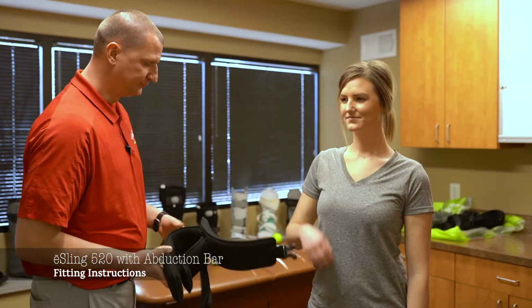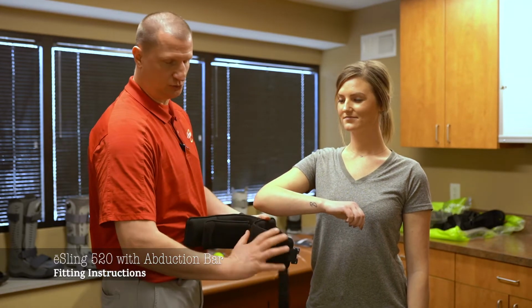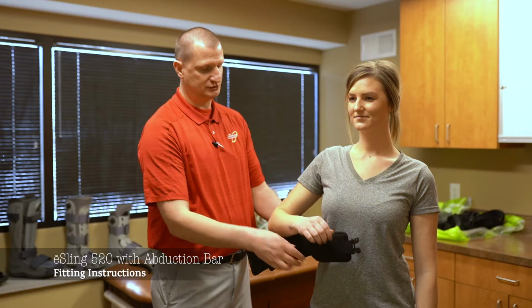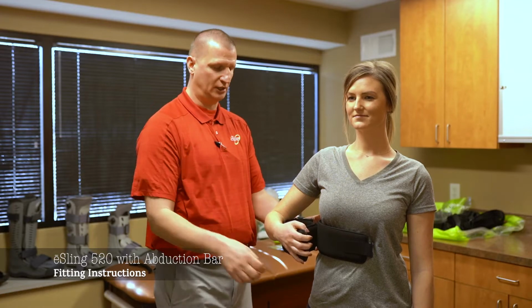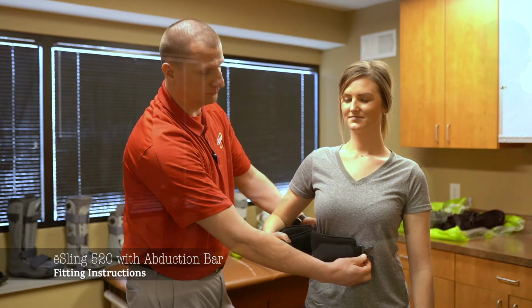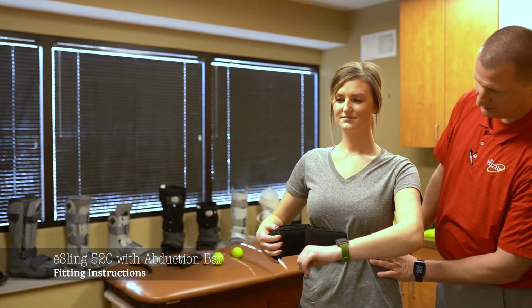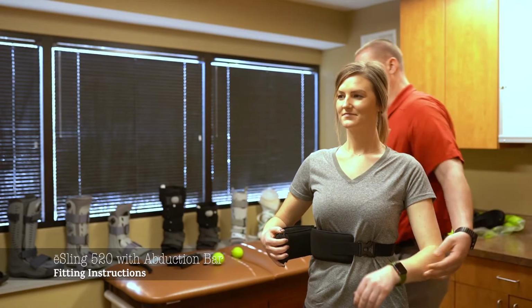We're going to cut the waist belt. This one's already been pre-cut. The positioning of this torso piece is going to be at the elbow height. This is not going to be at the hip. It's going to be whatever that humeral length is for the patient. A lot of times we just have her grab on the outside here to help fit her, and we're going to contour this around her body with the buckle being in the front. Like I said, this has already been pre-cut, but you do have the Y straps here to keep this on her side so she can get to it if she needs to make basic adjustments.